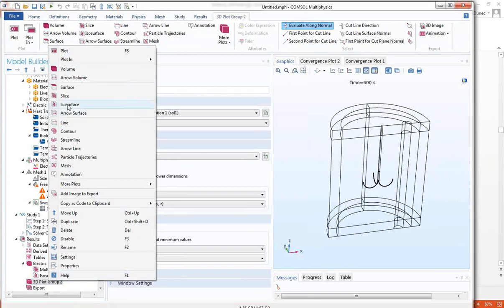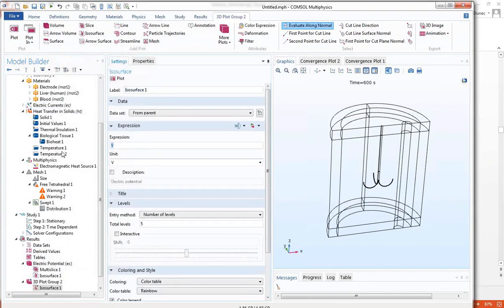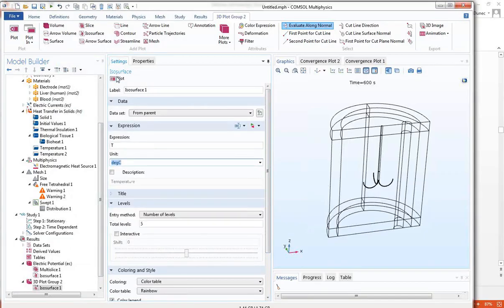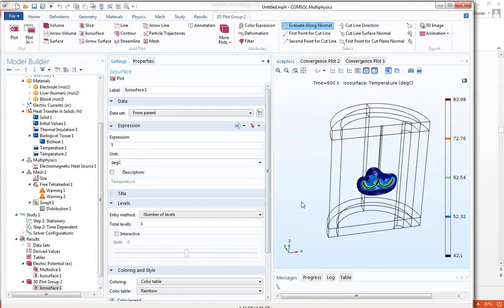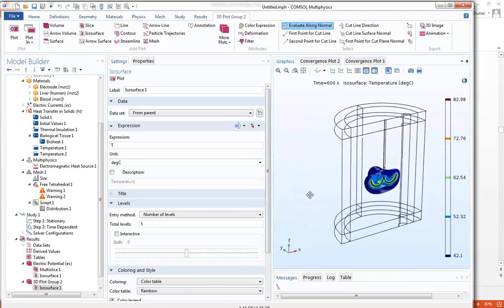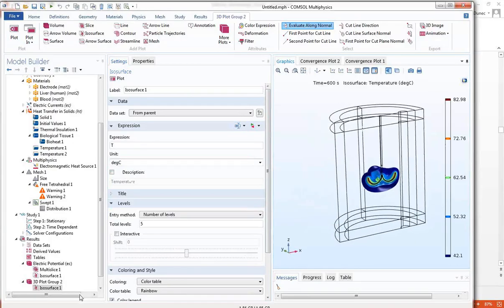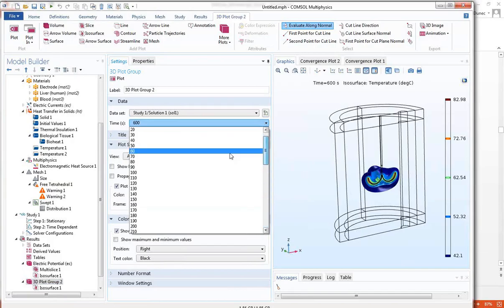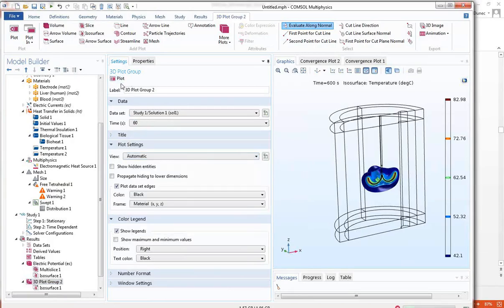I will add an isosurface plot, and in this particular case I want to plot temperature. We'll take the temperature in degrees centigrade and plot that. And lo and behold, now we've got what this looks like as a function of time. I could take this back in time, say 60 seconds, and of course it's smaller.